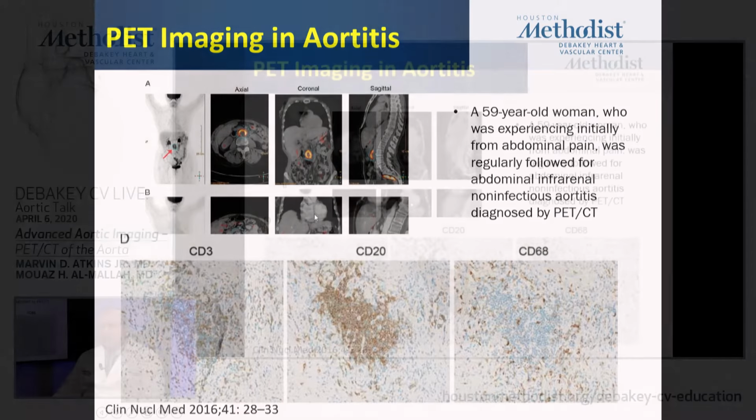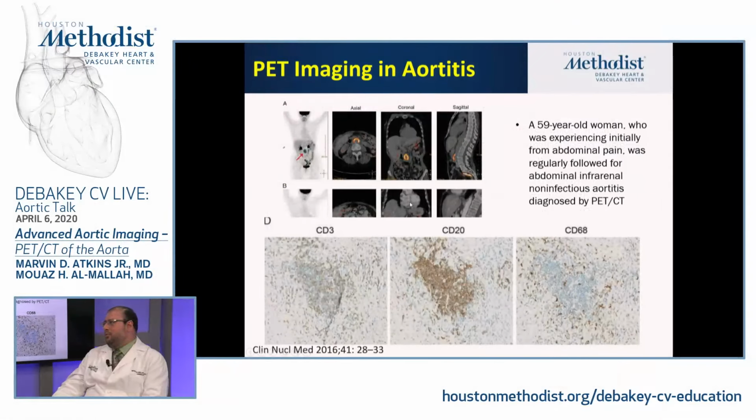So if you ask me which one would be the closest to clinical application, this is the area that will be closest, mostly in Takayasu arteritis and giant cell arteritis, this type of arteritis where you have to suppress them and use high dose steroids and sometimes other anti-inflammatory or immunosuppressive therapies, where it is very much needed to be able to control these symptoms. Otherwise, major complications could happen for these patients. Okay. And it allows you to adjust the dosages based upon imaging. Exactly.